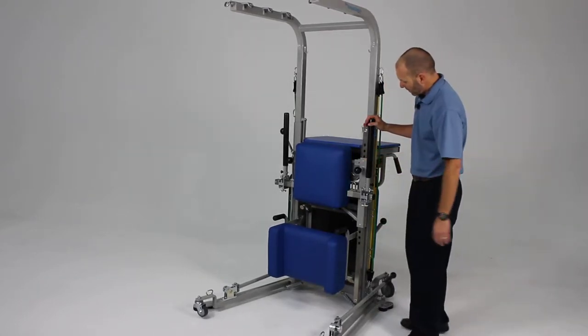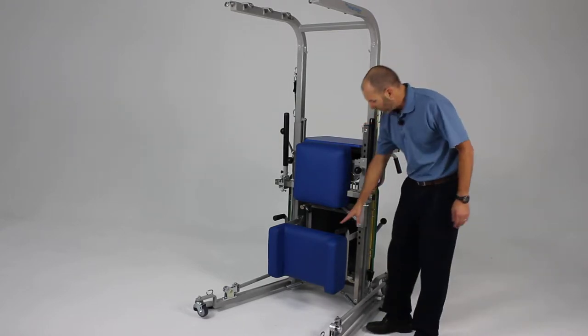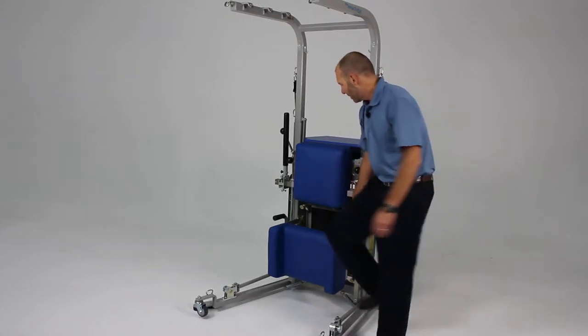On the front of the unit we have a couple of different features. First, we have a knee pad that can be placed — this is an accessory unit and does not come with the basic model, but it is a standing frame portion that can be added in the future.